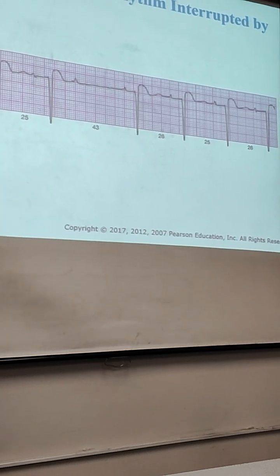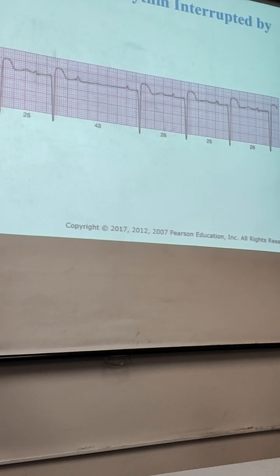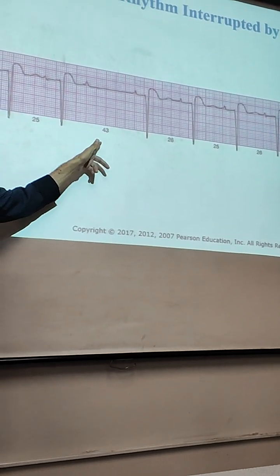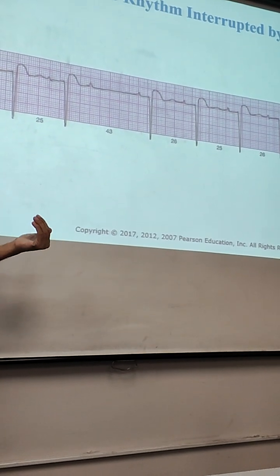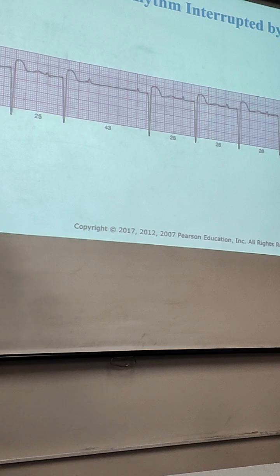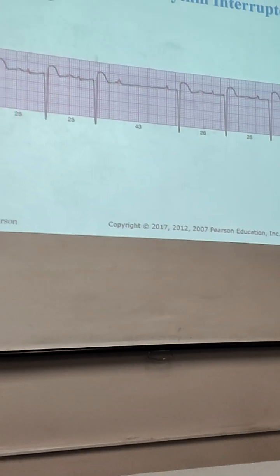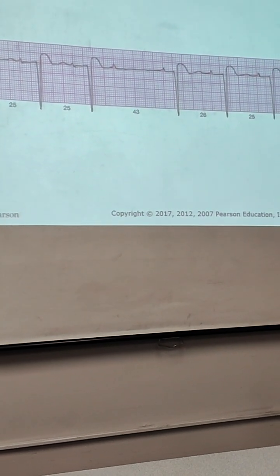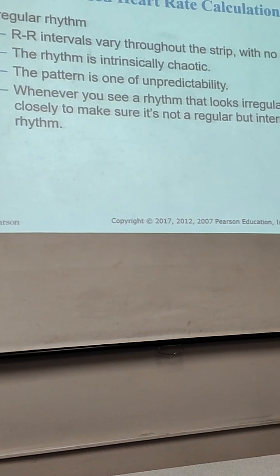One day you went too early, the office was not open. Then you learn your lesson, oh, this office opens at this time. So let's say that you were premature, you were earlier, or you were late. So the same thing. Whenever you see this regularity, but only one thing that does not match, something that is off, still consider it regular.